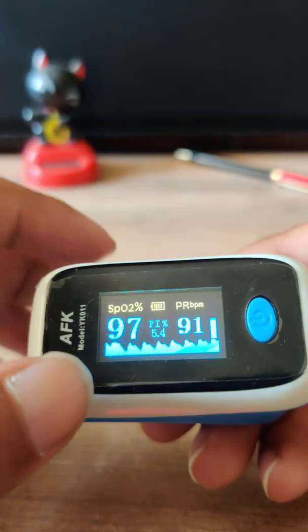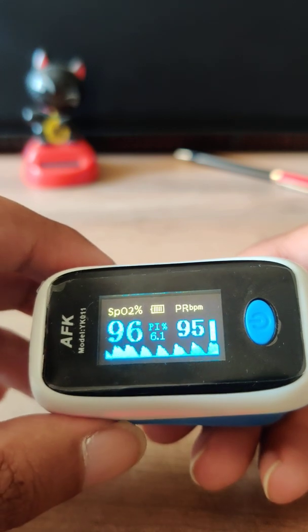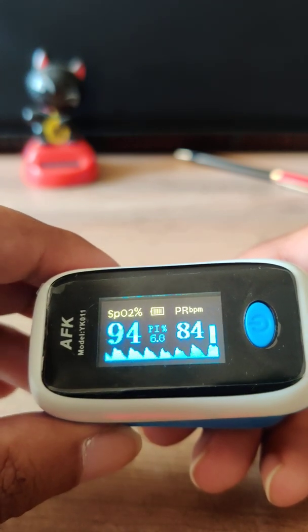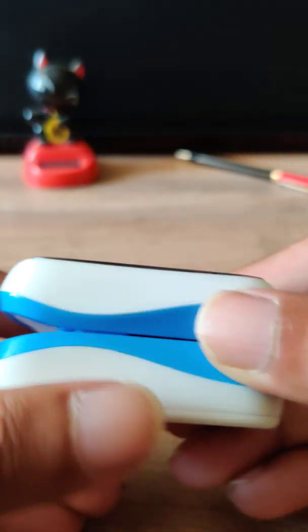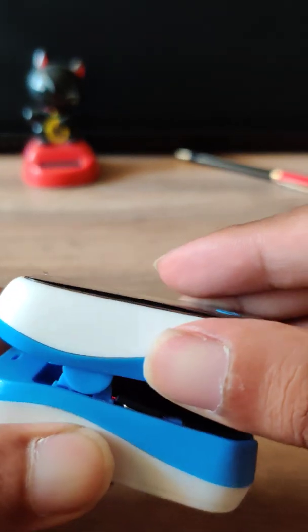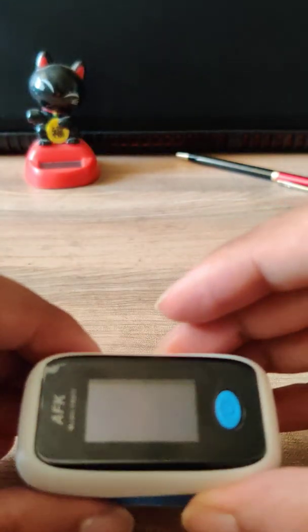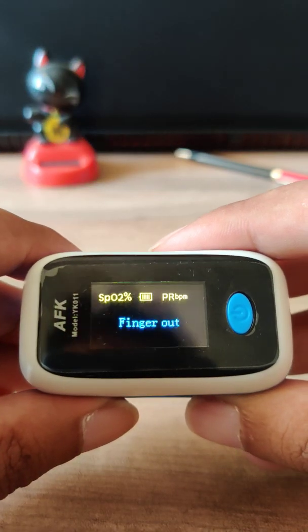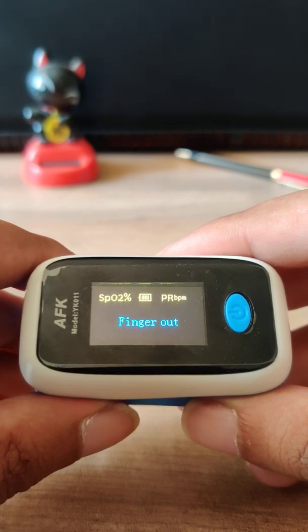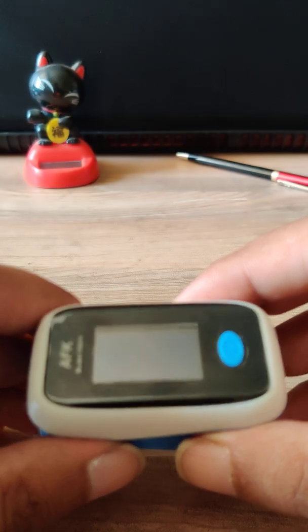It is necessary that the saturated oxygen level is always above 96 to 97 — that means you are healthy and need not fear much of COVID. The principle of this device is a red laser which you can see inside and a detector which you can also see inside. The device takes readings using this laser, which shines light through your finger and displays the reading.